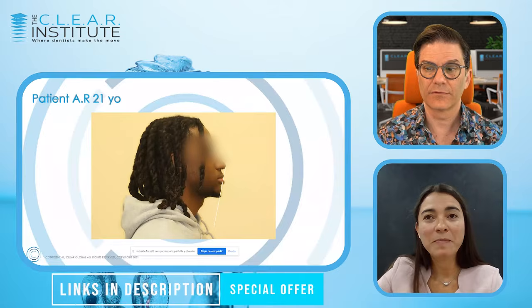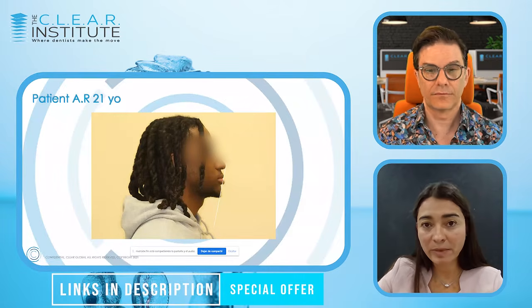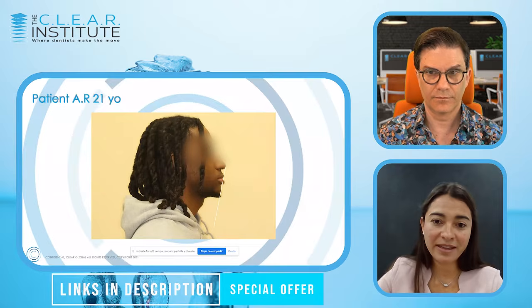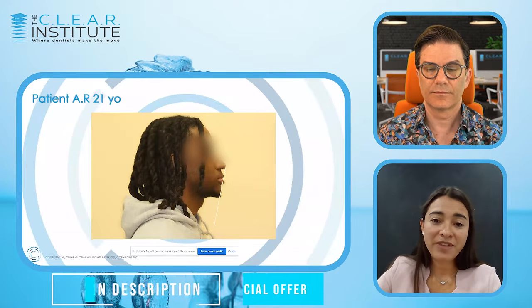And remember, that's the difference between a clear aligner company and a treatment planning service like C.L.E.A.R. That's it. Because there are clinicians at C.L.E.A.R. evaluating and diagnosing your case. Very good. So another very fun line to draw on your patient profile image is the Ricketts line.